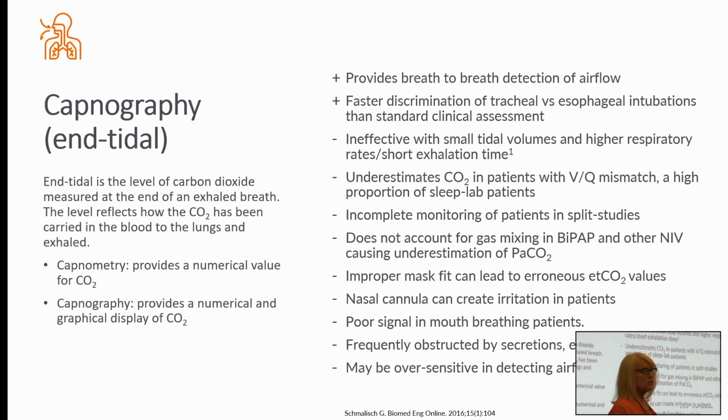So let's talk about the next method, which is end-tidal CO2 monitoring. As I mentioned before, it measures the level of carbon dioxide in the patient's exhaled breath. You might hear it referred to as end-tidal or capnography if you're getting a graph or a waveform, or capnometry if you've got a numerical value. So end-tidal has a couple of advantages.